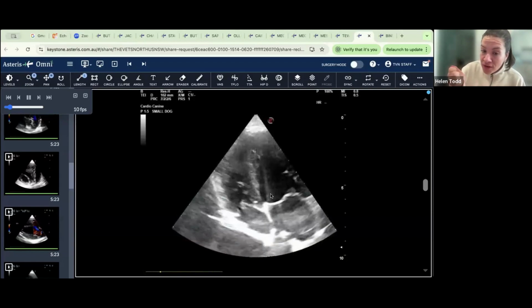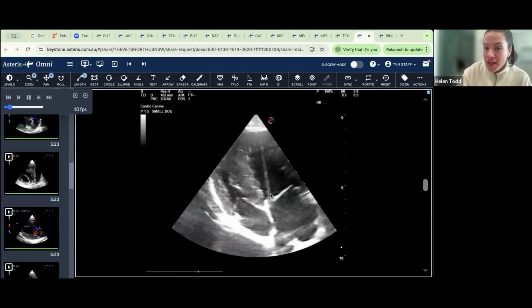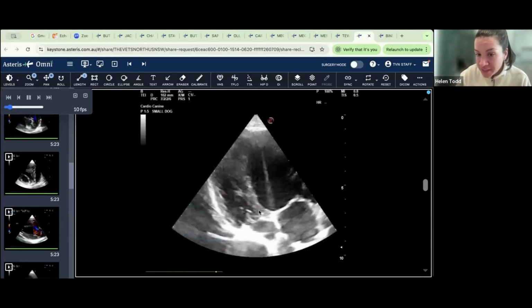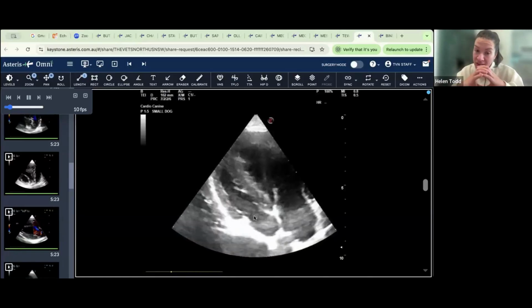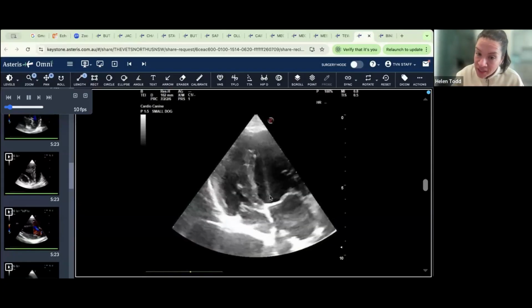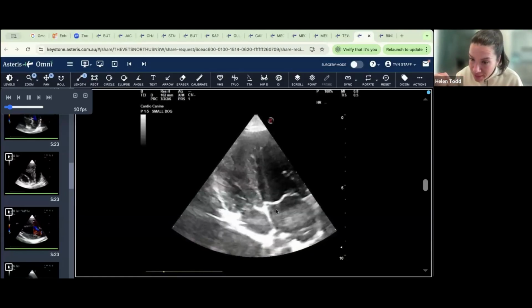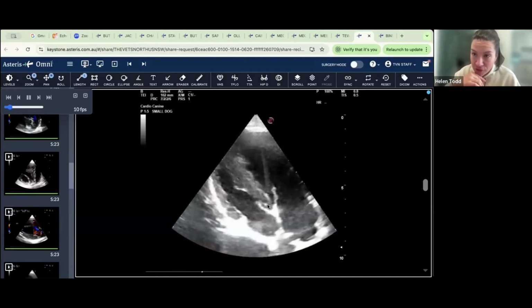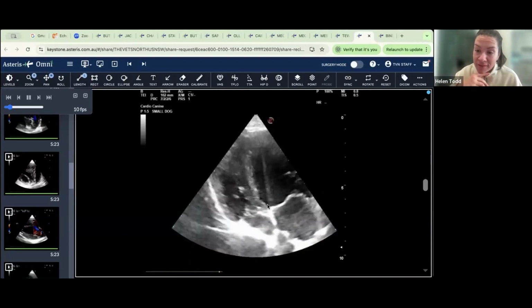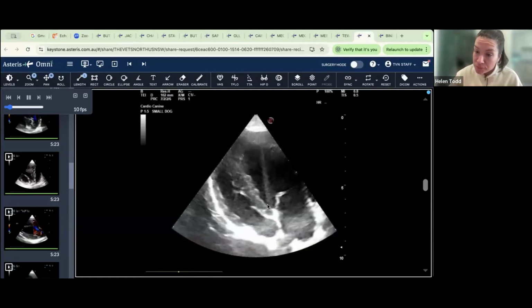And then I just make really gentle tilts. And by tilts, I mean I'm just moving the tail of the probe in either direction until my aortic valve is visualized coming in here. And often, because it's quite a nice bit of anatomy that's quite well defined, I do my LVOT right down here in this view, and then get the aorta just coming in, and then you can do your aortic view with your color flow. I have to say that it takes a lot of patience. I mean, hundreds of patients, I honestly think, to be really comfortable doing those views.